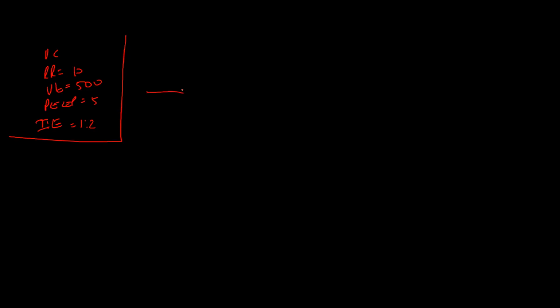When you want to switch to pressure control, that's fine. You can do that. So you're going to say respiratory rate equals 10, because we're at 10 over here. We're just going to mimic it. PEEP equals 5, we're not changing that. IE ratio, you can see what the IE ratio is over here, so you can set the IE ratio to 1 to 2, and that gives you the same IE ratio. Now we're stuck with tidal volume.